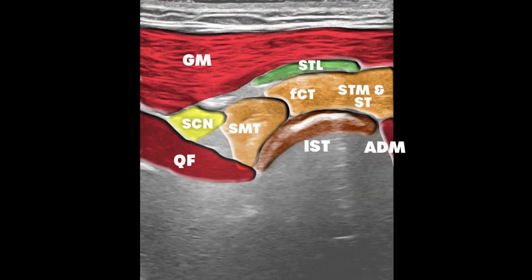The ischial tuberosity, known as the sit bone, has distinct facets that serve as proximal attachment points for the hamstring muscles. The lateral facet primarily anchors the semimembranosus muscle, while the medial facet anchors the conjoined tendon of the long head of the biceps and the semitendinosus.